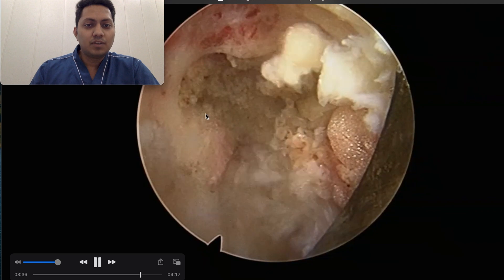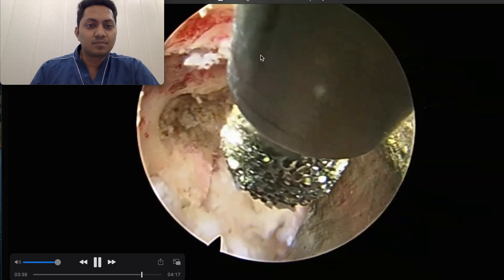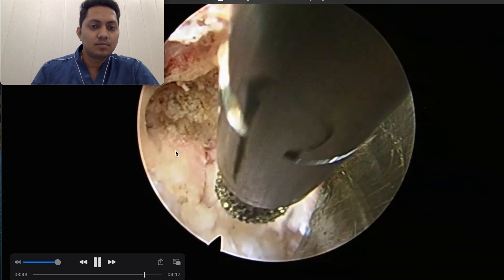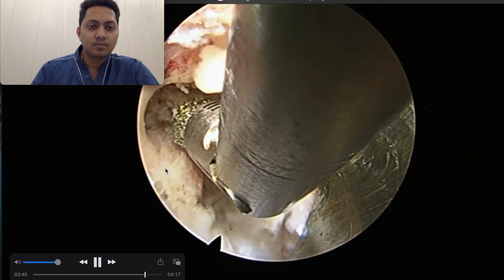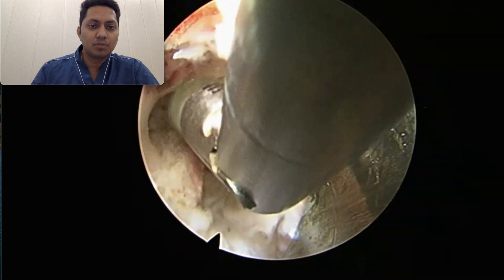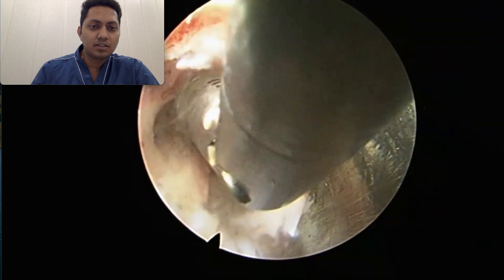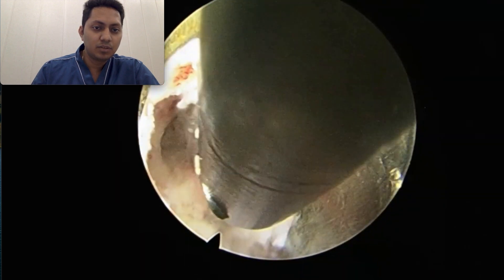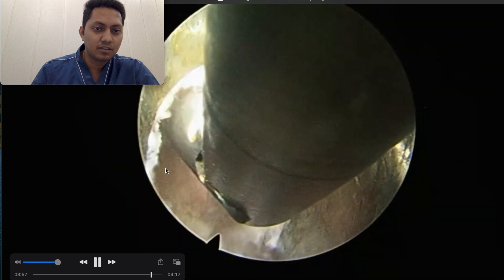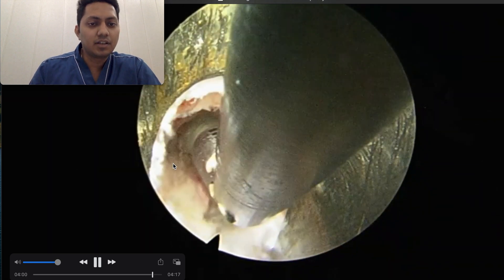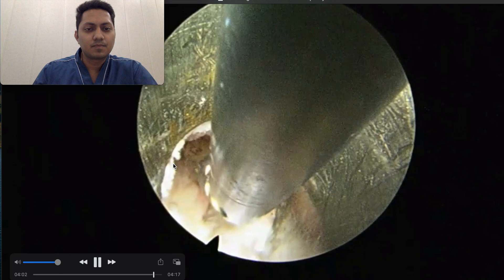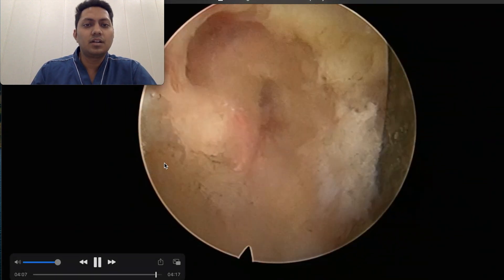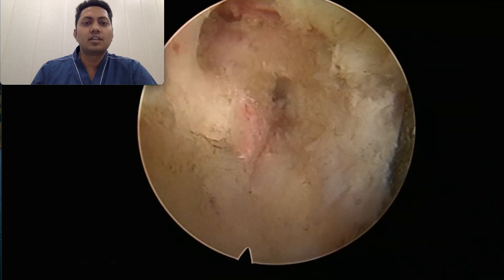Look how much we have increased this area. Again, we must remember to be very slow and precise in whatever we are doing. Take out minimal bone — as much as required — and be very targeted about what you do.